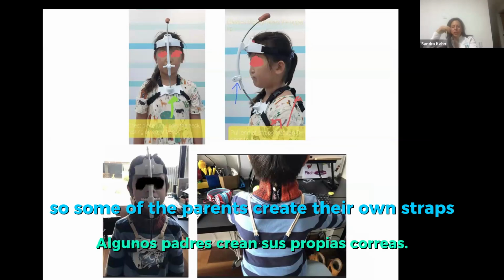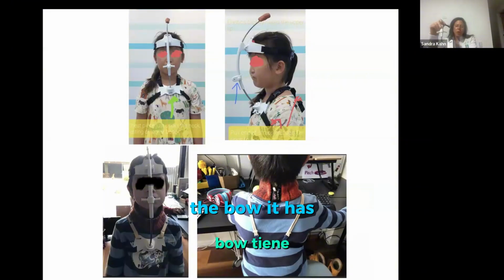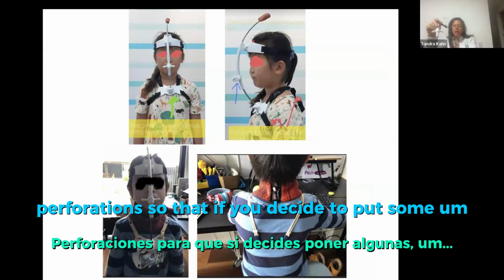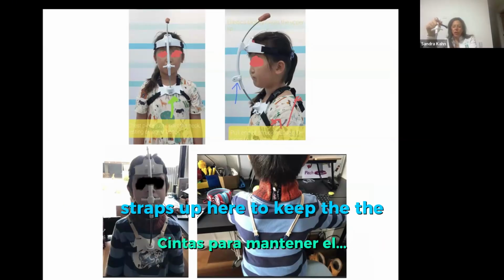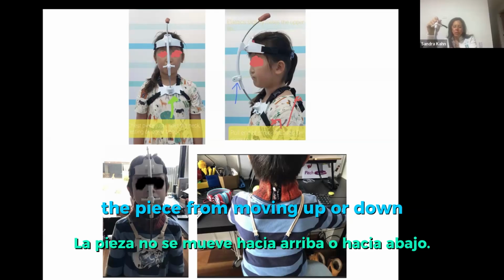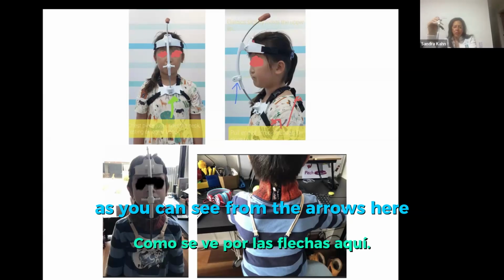So some of the parents create their own straps. If you look at the chest piece of the bow, it has different perforations, so that if you decide to put some straps up here to keep the piece from moving up or down, usually it's up that it tends to move, as you can see from the arrows here.